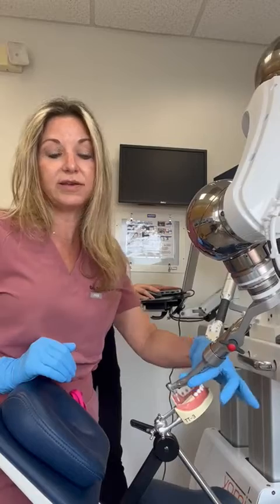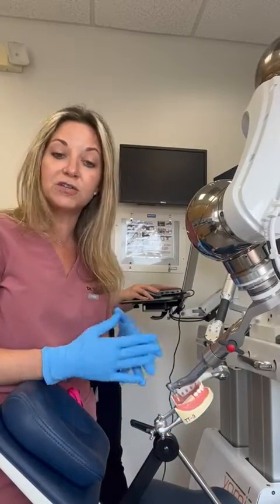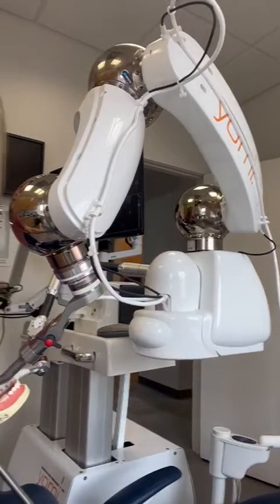It actually locks the handpiece so that it can't hit into any vital structures such as nerves, arteries, other teeth, sinuses, or anything of that sort. So here again, this is the Yomi robot and this is the latest technology, and we have this here at Implant Center of Miami.